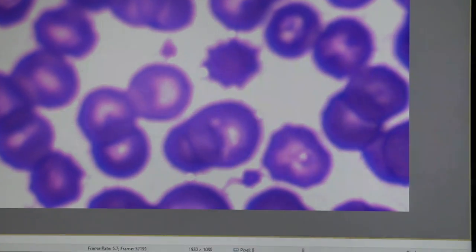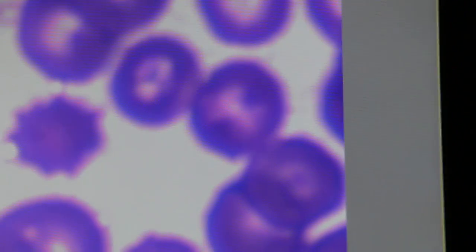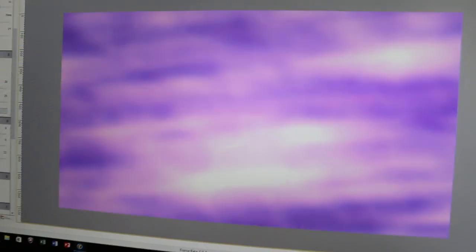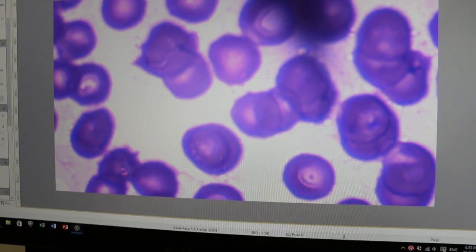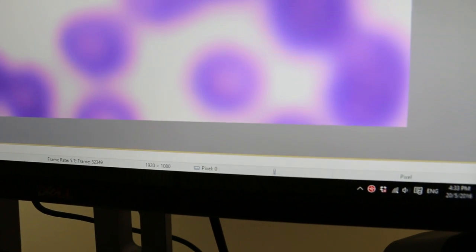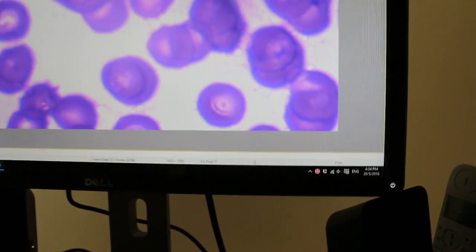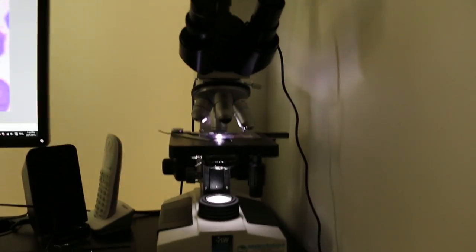Since there is a lot of Babesia inside the red blood cell, almost every view you can see the parasites. See one here, lower part. One here. So you do a peripheral blood smear.